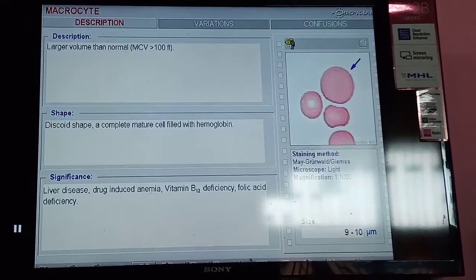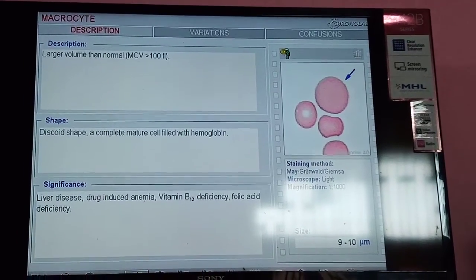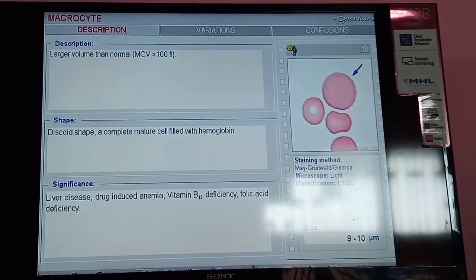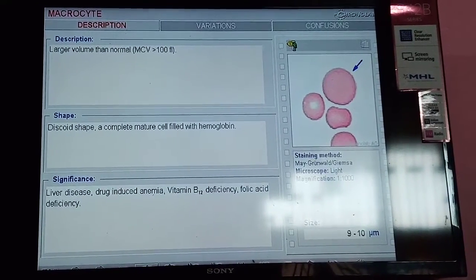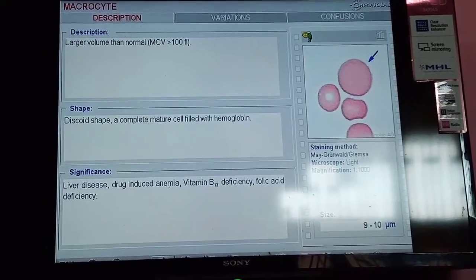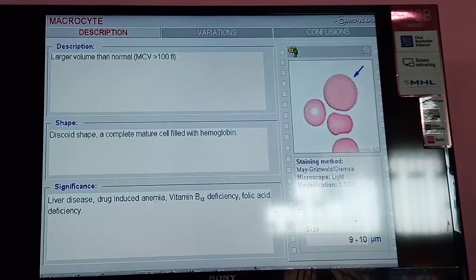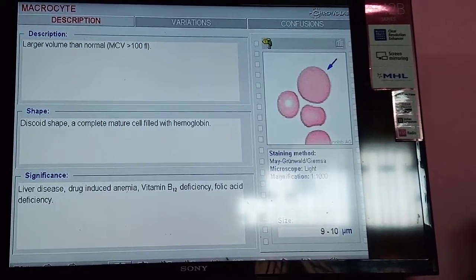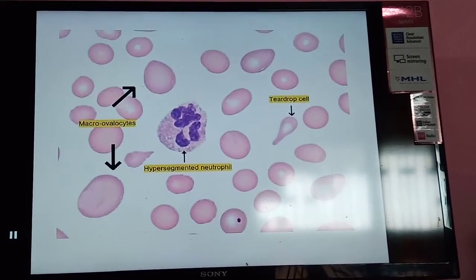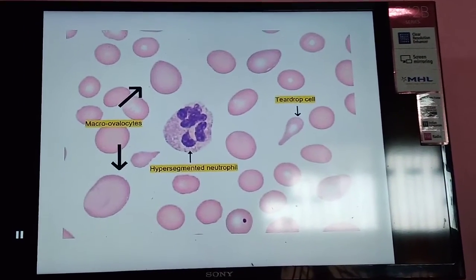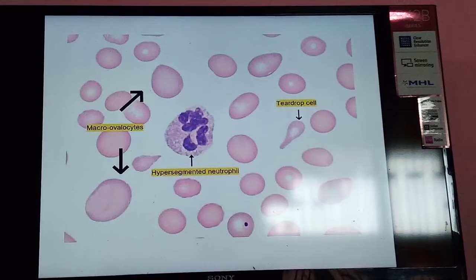In the blood picture of macrocytic anemia, macrocytes have larger volume than normal RBCs, usually MCV more than 100 femtoliters. The RBCs are described as complete mature cells filled with hemoglobin. This pattern is seen in liver disease, drug-induced anemia, and B12 or folic acid deficiency.